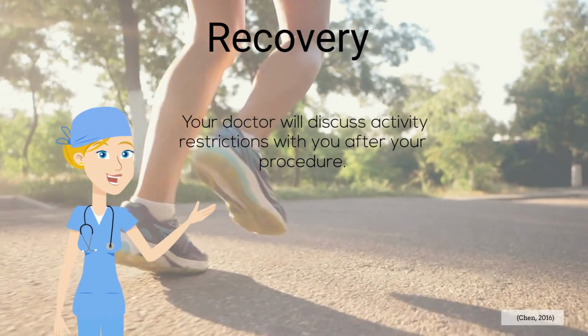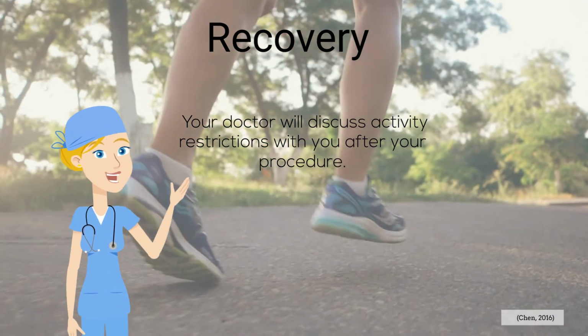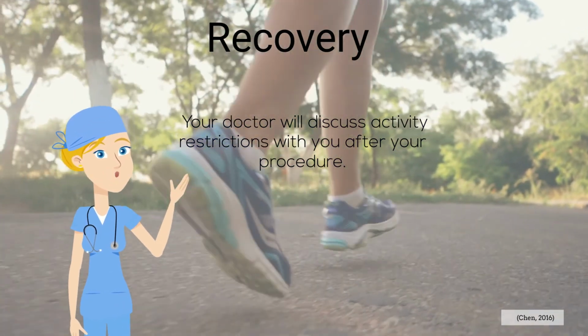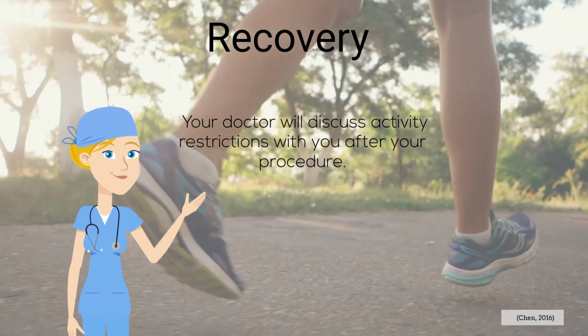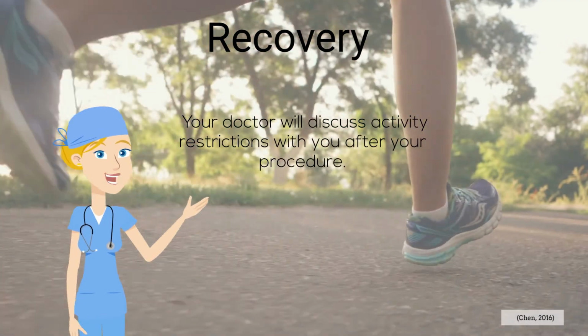Most patients are able to walk around within 6 hours post-procedure and are discharged home the same day. Recovery time varies, but is generally less than 1 week. Your doctor will discuss activity restrictions with you for your recovery period.